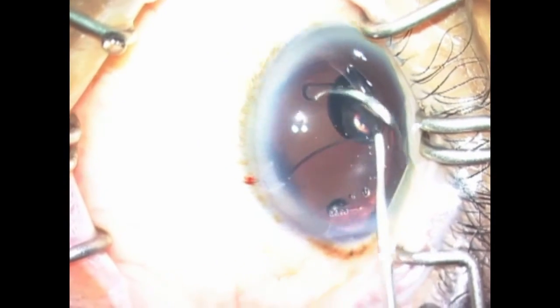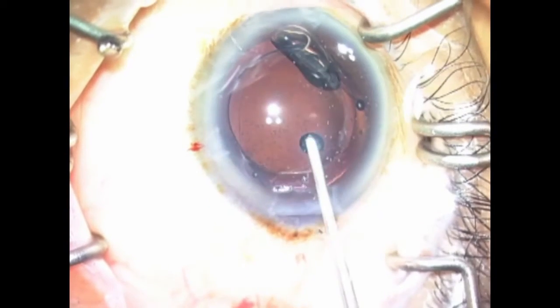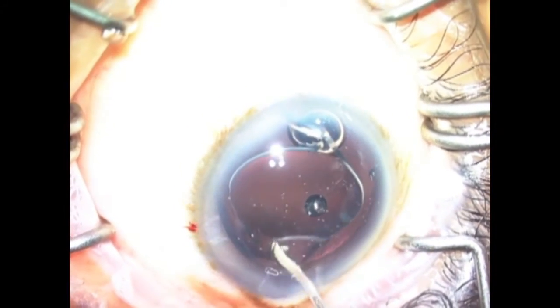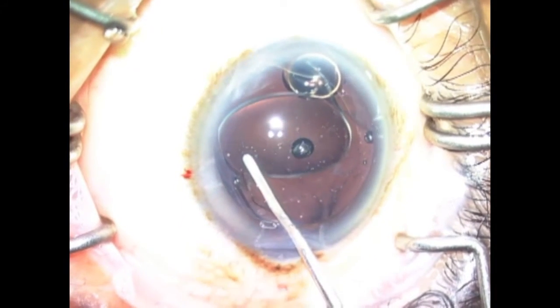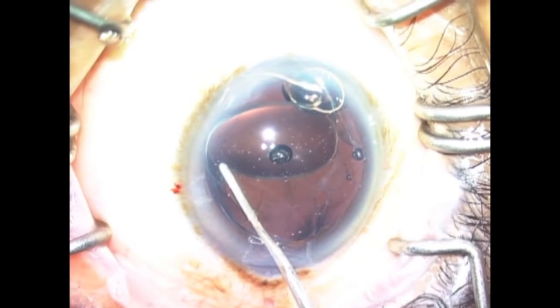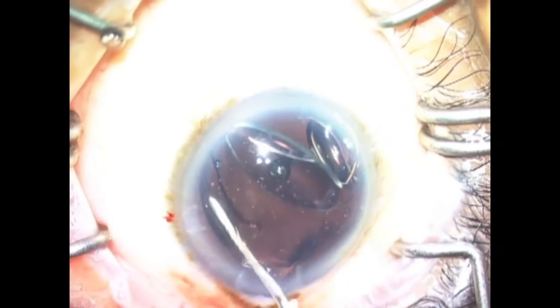Step 6. Rarely it is necessary to cut the haptic and leave it behind. Some intraocular lenses have a terminal bulb on the end of the haptic. With generous use of viscoelastic, these haptics can be freed from the capsular bag.